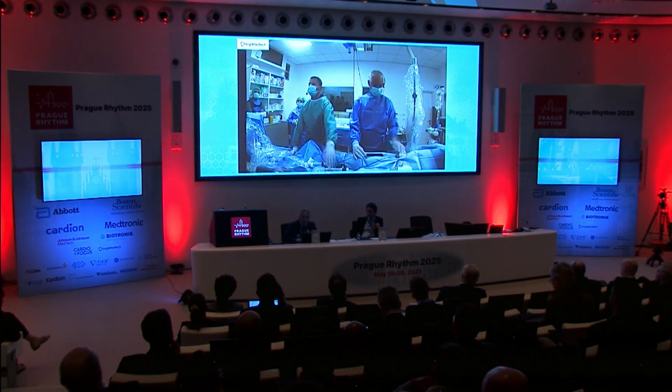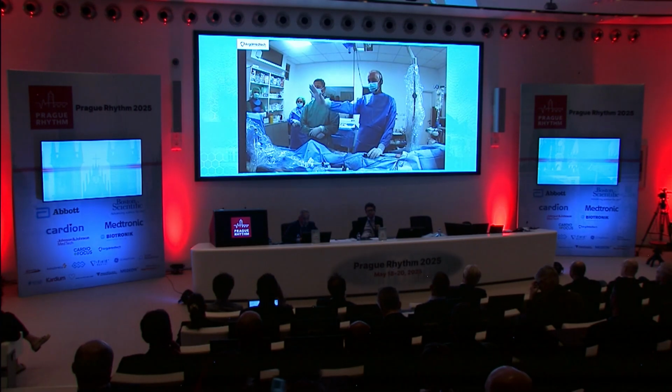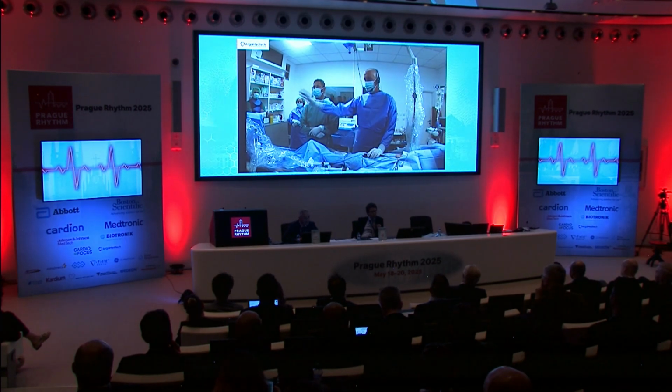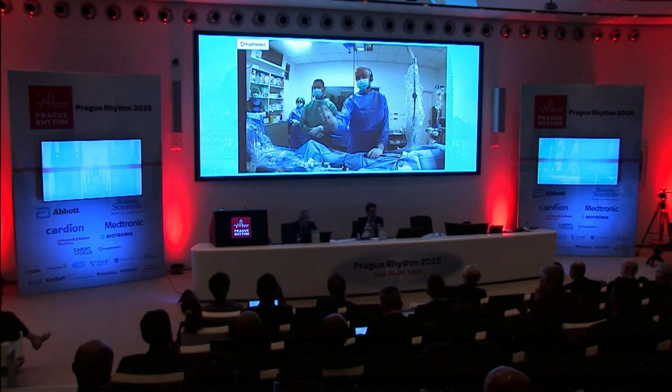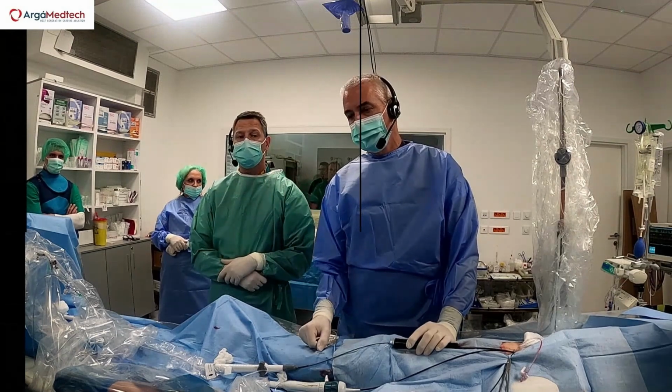More questions? That is impressive for the CTI. Do you need to reinforce it? I will reinforce. Okay, guys. For the purpose of this meeting, I will leave it like this, and in 1 year I have to report durability. Okay? Fair? Okay.